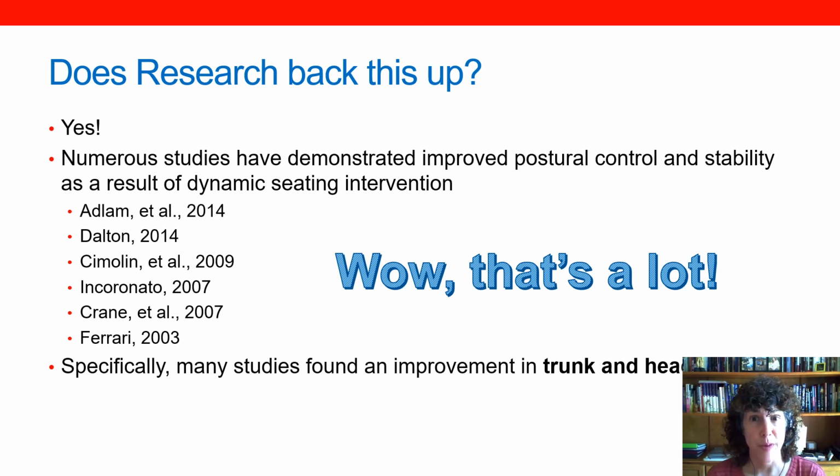So does the research back this up? Well, yes, it does, which is great. There have been numerous studies which have demonstrated improved postural control and stability as a result of dynamic seating interventions, and they're listed here. So we have quite a lot. Now, some of this research could be stronger. Some of this research could include larger groups of participants. Some could be a little more current.